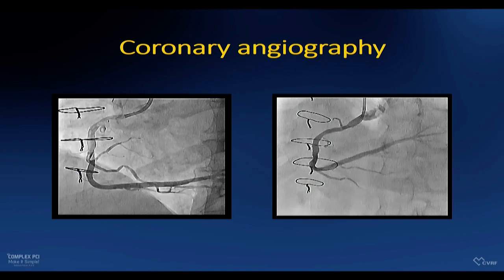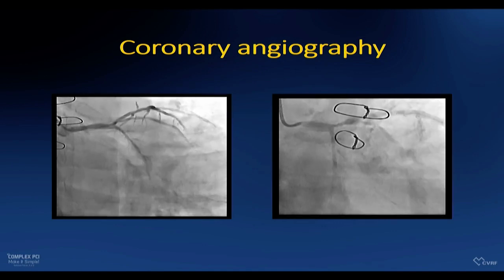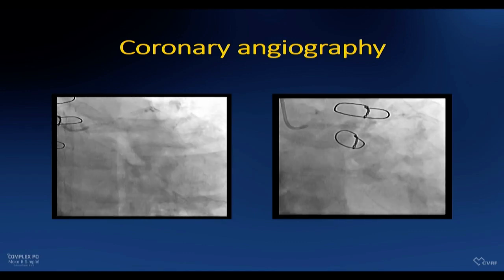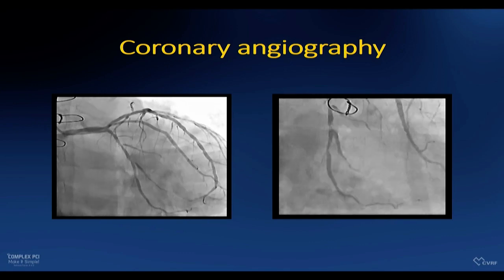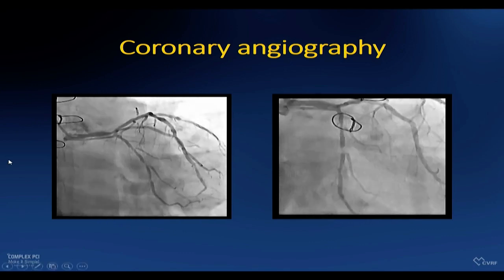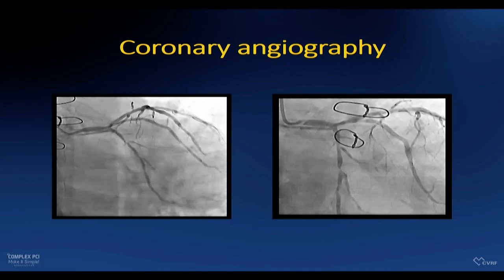This is a control angiography. RCA is well open. And next. The circumflex is a little bit diminutive. However, there is quite diffuse and tight stenosis from the proximal to mid circumflex. And also, the left main distal bifurcation shows very tight stenosis. And next.